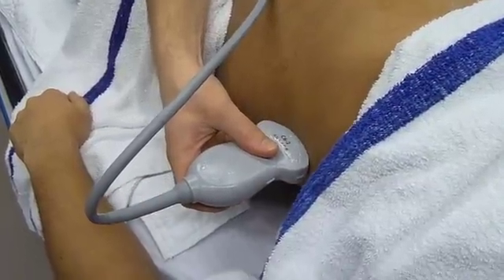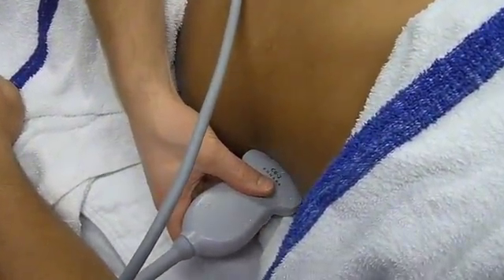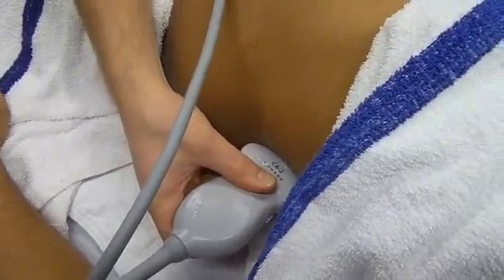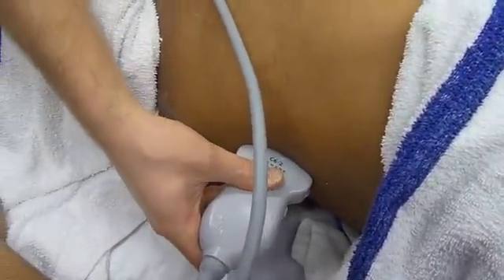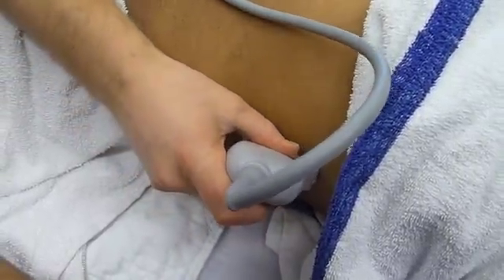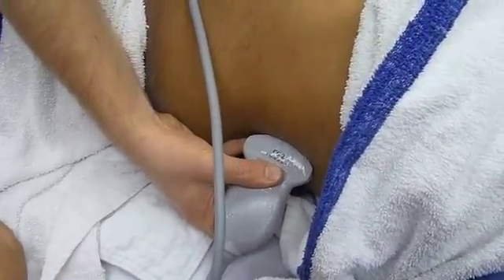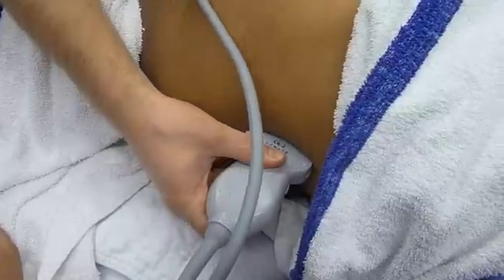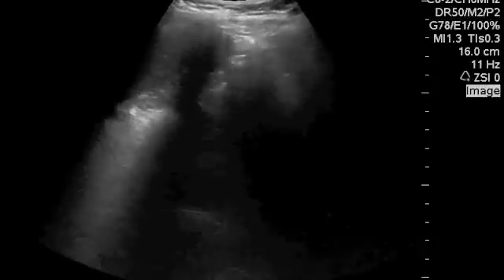Now let's do the left upper quadrant. The procedure is basically the same. Here I'm making my AP move until I get the largest possible view of the kidney I can get. Now I'm making my longitudinal move to find the interface and the diaphragm. Now I'm sweeping. Here you'll see the kidney come into view with my AP move — there it is.